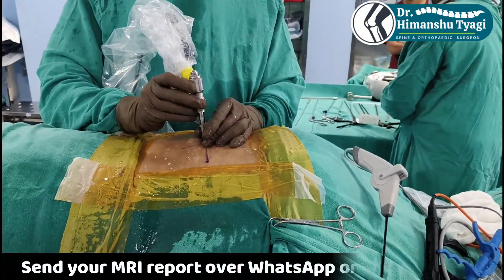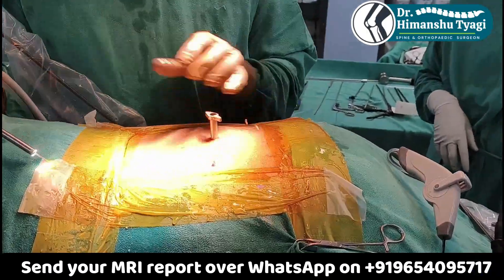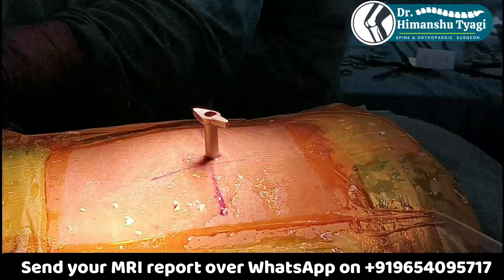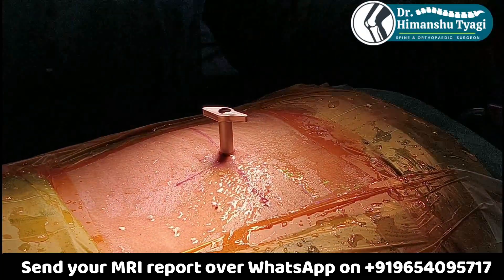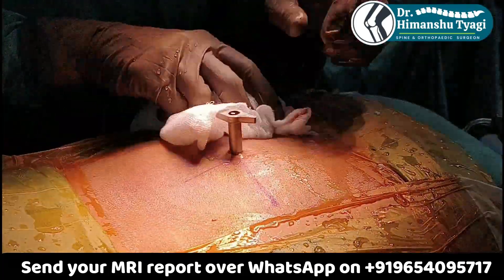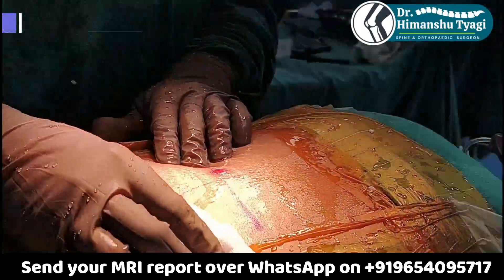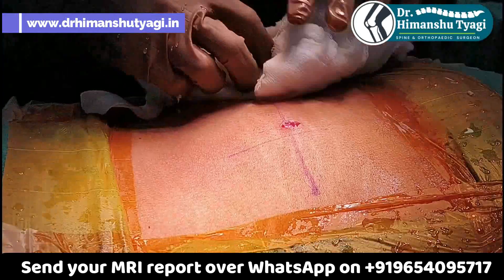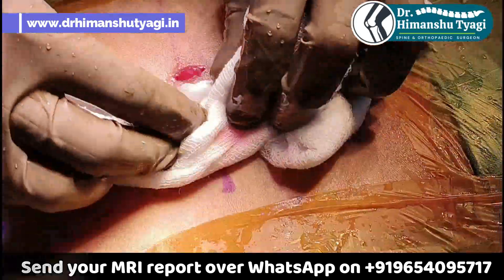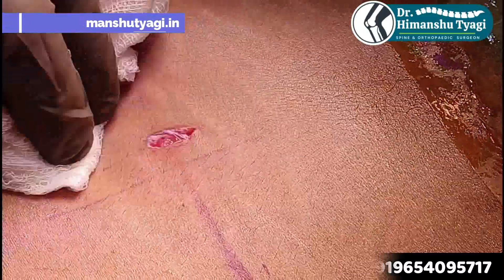Now we remove the scope, and once we remove the scope you can see everything was done through this small tube only — the outer diameter is around 7 millimeters. There is no need to do any special closure or take sutures. We just take one skin suture, and most of the time even that suture is not required. This is the end of surgery.